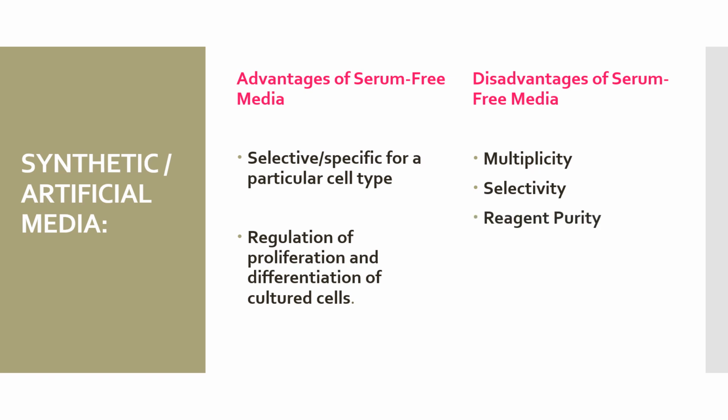Then we have the reagent purity issue. The removal of serum also removes the protective and detoxifying action of some serum proteins. So the removal of serum also requires a higher degree of cleanliness and aseptic conditions of glassware, reagents, water, etc. Slower cell proliferation and growth. And then it's more expensive. So the availability of properly controlled serum-free media is limited, and so the products are often more expensive than conventional media.